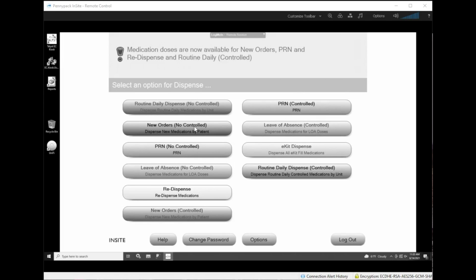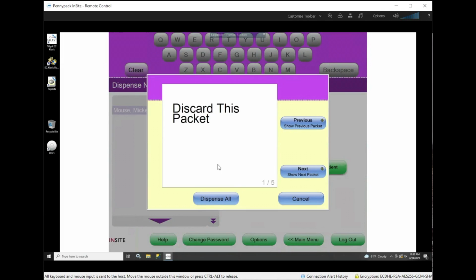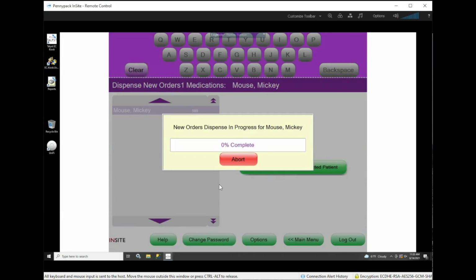So today we're going to talk about jammed or empty canisters. When you go to dispense a medication, sometimes it will immediately tell you that there's not enough drug in the machine. Or it might tell you, in this case, get all the way to the end of the dispense and then say that medications were skipped because they were missing.